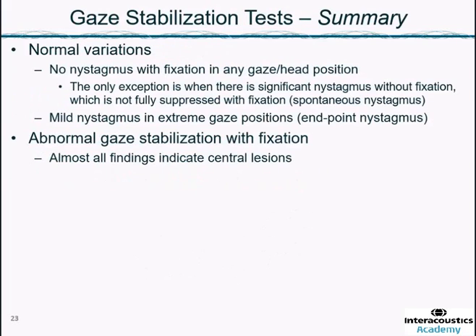So, to summarize what we talked about, in normal variation of gaze stabilization tests, you typically do not see any nystagmus with fixation in any gaze or head positions.